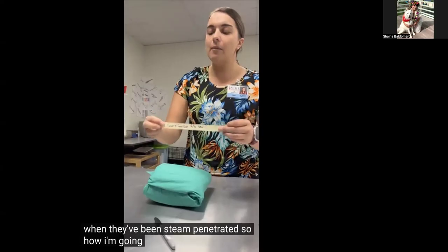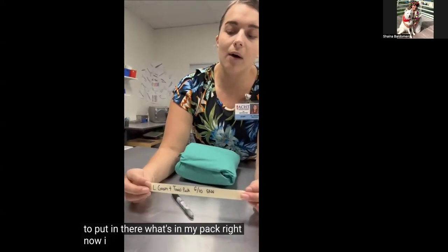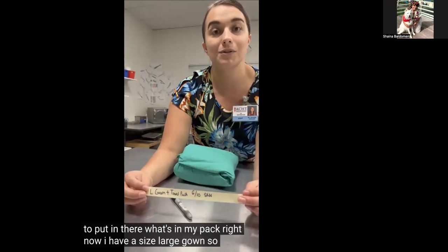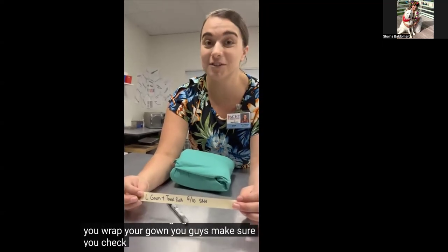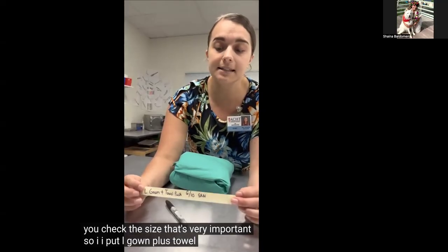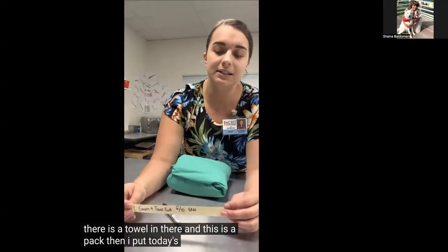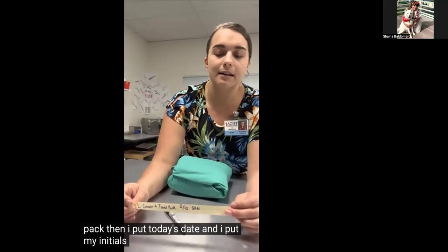So how I'm going to label my tape is I need to put in there what's in my pack. Right now, I have a size large gown. So before you wrap your gown, you guys make sure you check the size. That's very important. So I put L gown plus towel because there is a towel in there and this is a pack. Then I put today's date and I put my initials.